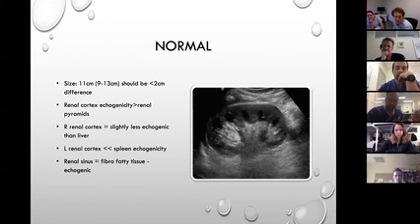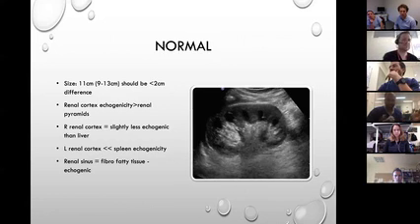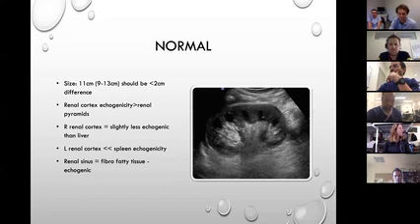Okay. All right. If you actually go and see a pediatric kidney, like really young ones, all you see is a big blob of liver and the kidney tissue, and just a capsule in between. They almost match the echogenicity. You don't even differentiate it. But when adults come in, if you've got fatty changes in the liver, because fat is quite reflective and it absorbs and there's a lot of reflection going on, you get a brighter liver and a duller hypoechoic renal cortex. Thank you very much. Cheers.